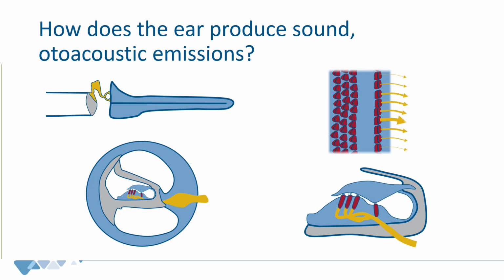Now, this moving along with the sound is basically those outer hair cells vibrating at such a frequency that it's producing the same sound as what was presented into the ear. And because this movement is producing sound, the sound from the outer hair cells travels back over the basilar membrane outwards and then ends up in the ear canal.